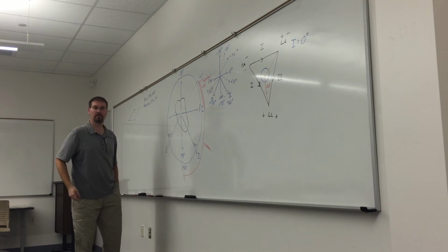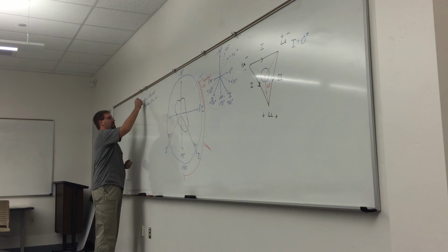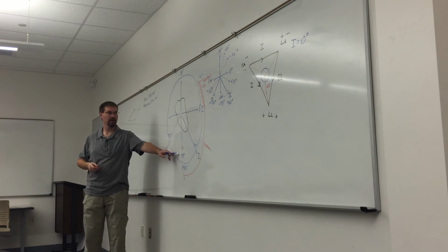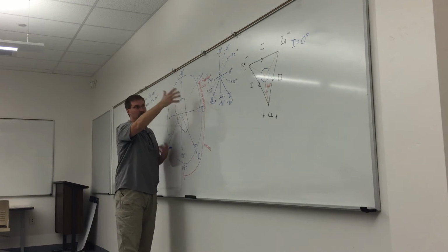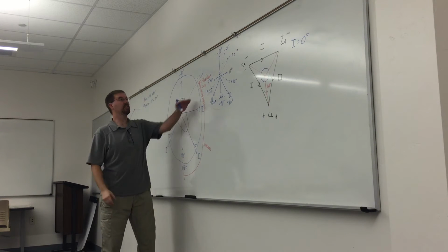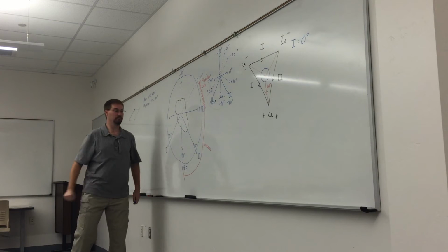Did you just say the normal axis is -30 to +90? Yes, but physiological left axis deviation is a subset of normal. Oh, you put 0. Yeah, 0 to positive 90. That's absolutely perfectly normal. Then you have from 0 up to negative 30, which is normal-ish, but it's what we call physiological LAD. So we're not as concerned about that. This is like our wiggle room here. I'm sorry if I confused you. That's cool. Okay, you guys good with that?